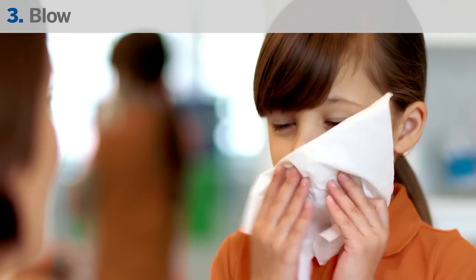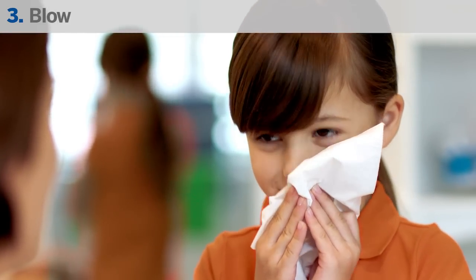Before using Children's Flonase, have your child blow their nose gently to clear their nostrils.